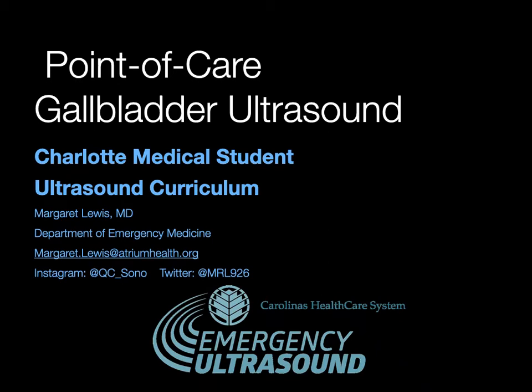Hi everyone. So today we're going to talk about point of care gallbladder ultrasound. This is a little bit different from your comprehensive right upper quadrant ultrasound through radiology, in which you're examining all structures in the right upper quadrant, but today we're focusing in on the gallbladder.